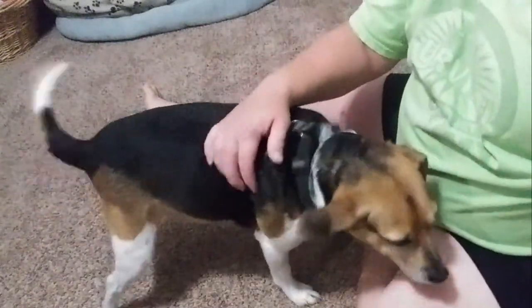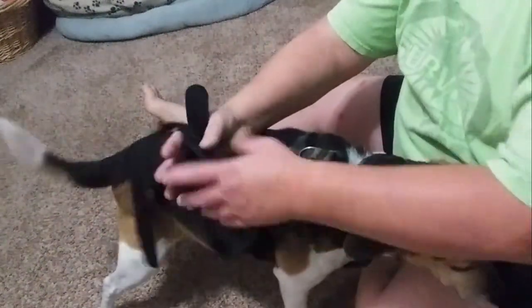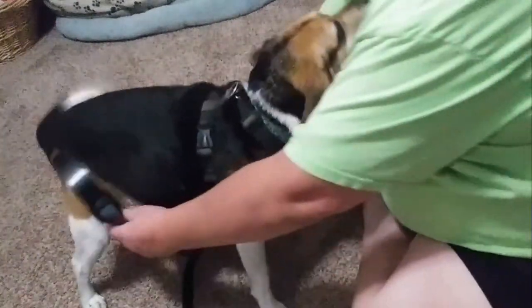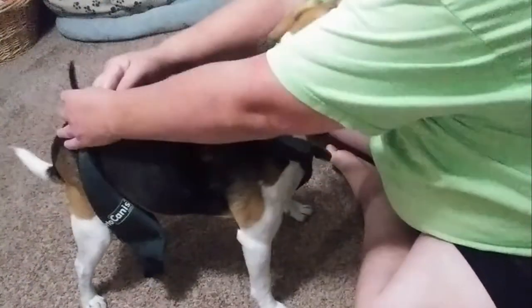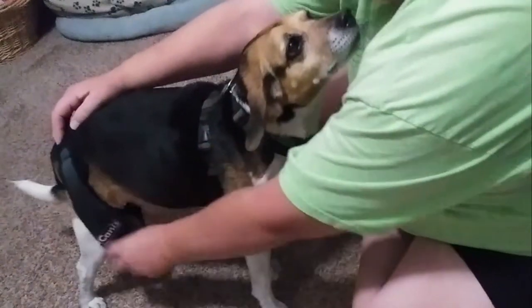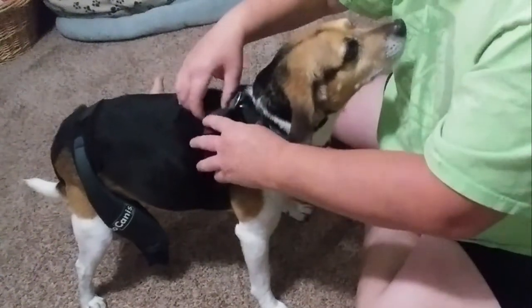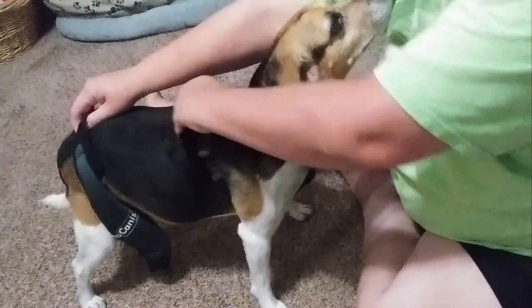It's been about eight weeks since he tore that ligament in his back leg. The problem is, if you put this on and put the strap around them, the strap kept sliding off. I did see ones where they had a strap from here up to the harness, but I was afraid that if this slides down it's just going to choke him.